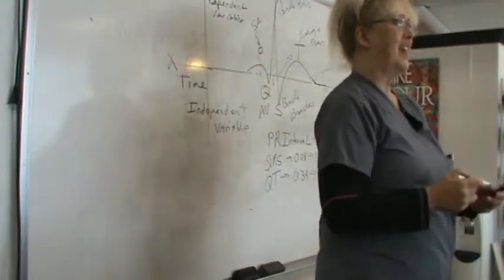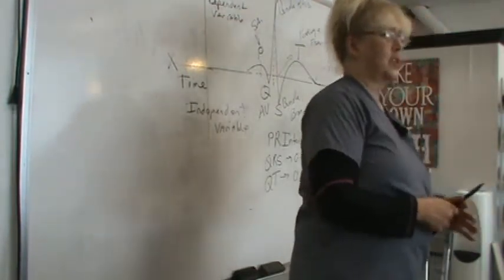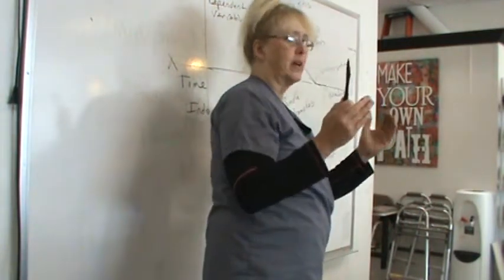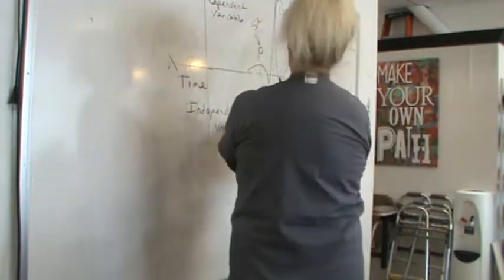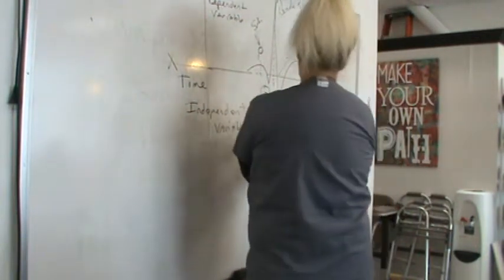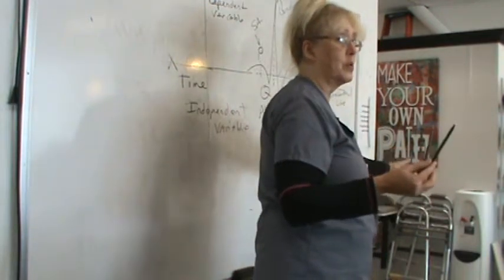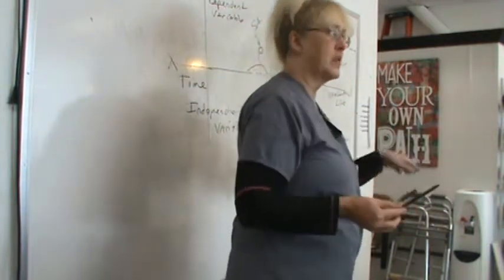Now I'm not guessing. Where's the curve? Where do I start? Where do I end? That's just a waste of mental energy. Drop your perpendicular from the apex to the highest point, where you can draw a tangent line to the point, and measure the distance. There's my distance. Take your calipers and measure. If it's a PR interval, it falls within the normal range between 0.12 and 0.20 seconds. Now I'm going to show you what we mean by seconds on the horizontal in a minute.